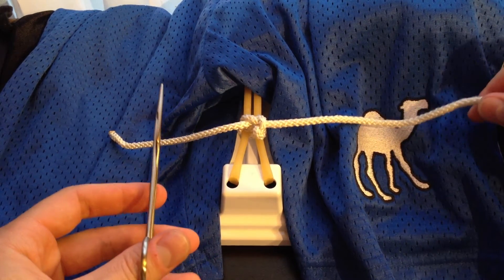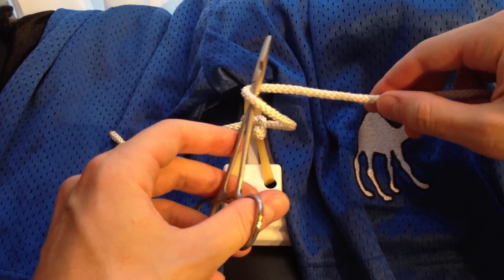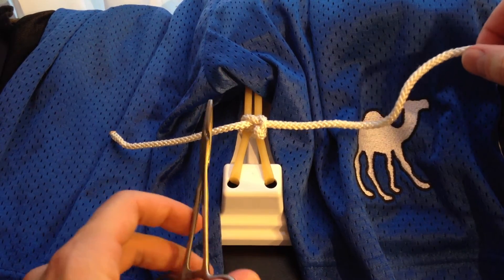With the instrument tie, essentially you're bouncing your hands back and forth, looping it once around the instrument, grabbing the short end, and pulling it in the opposite direction. So let's do this one more time.